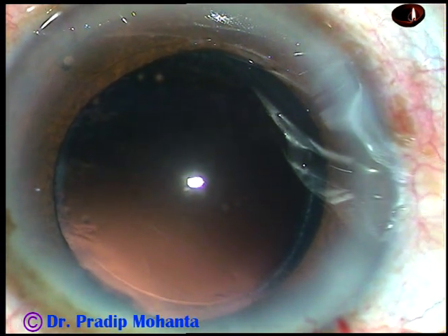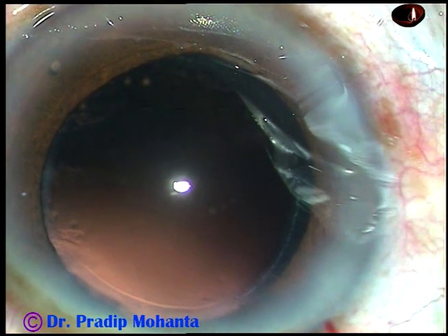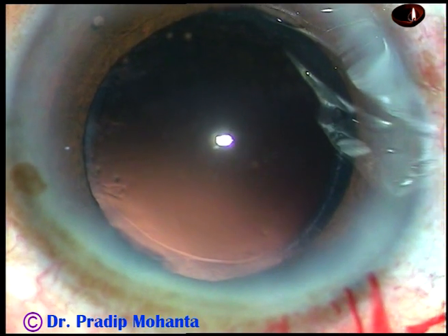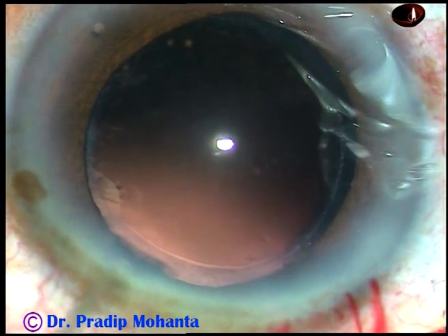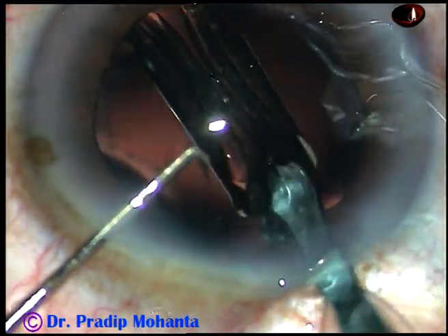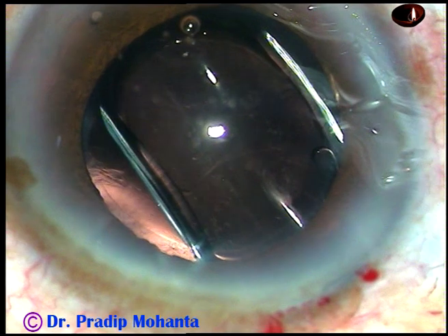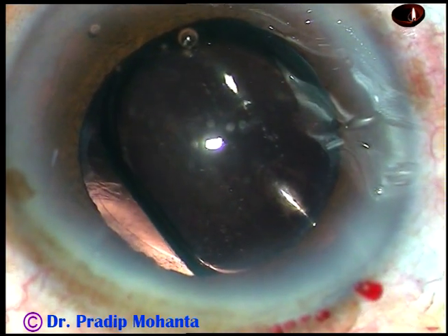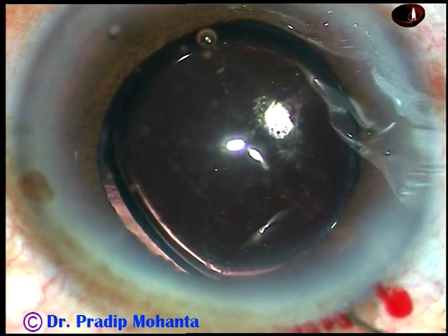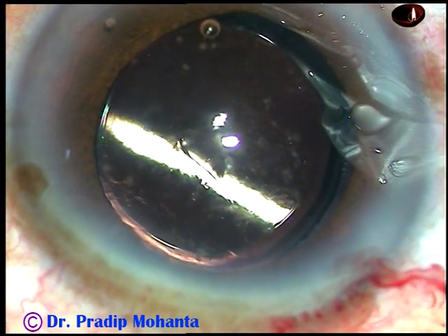Now, in this case, I am going to use a B cartridge. So, I increased the main incision by 0.2 mm — the main incision which was 2.8 mm has become 3 mm now. And this is the B cartridge and here goes the intraocular lens. This is a single-piece hydrophobic intraocular lens. The lens goes into the capsular bag. Just by gentle taps at the haptic-optic junctions by the left-hand instrument, the lens goes into the capsular bag. The haptics take shelter at the equatorial region of the capsular bag.